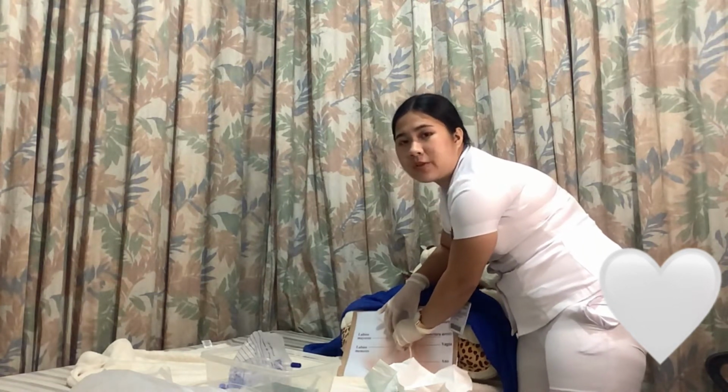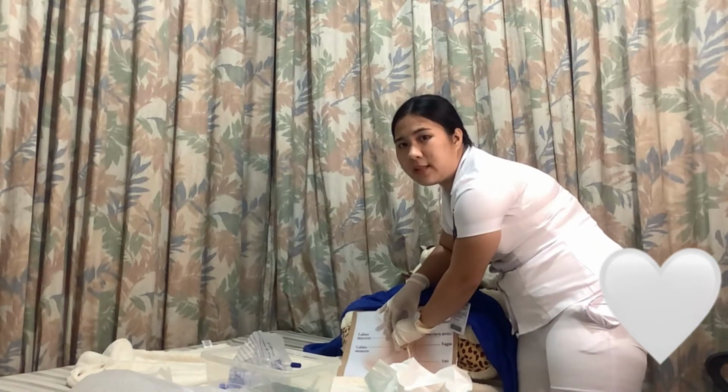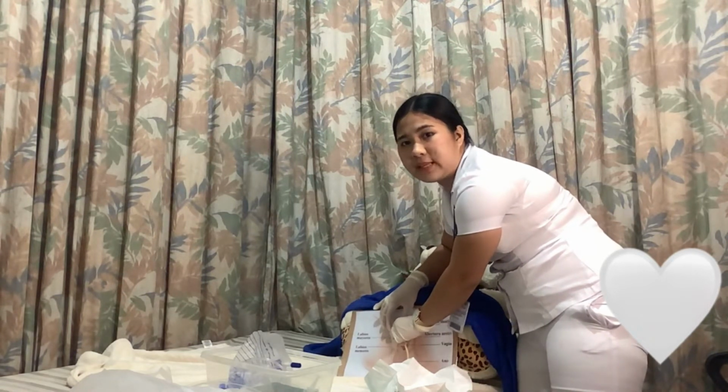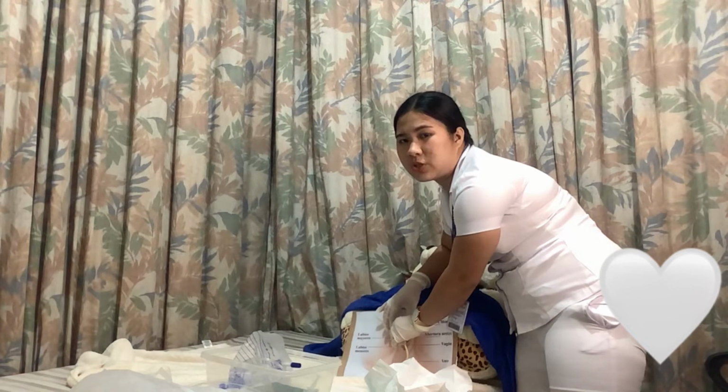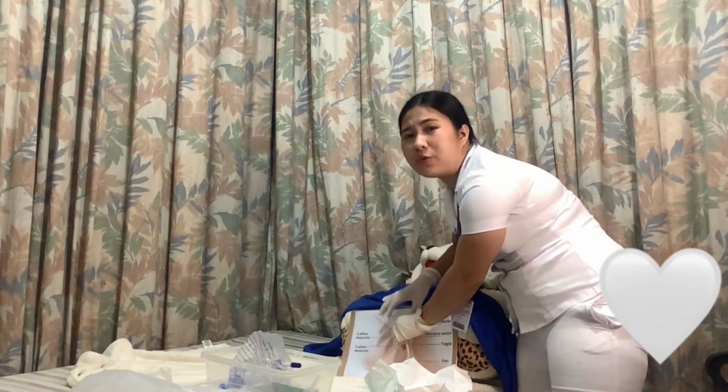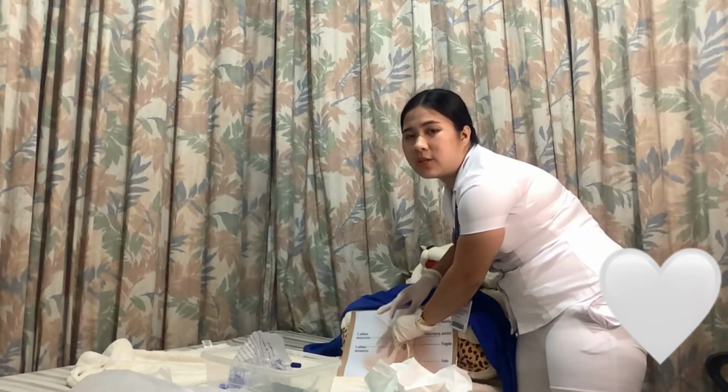Okay. So next, the first specimen is to be collected. Pinch the catheter with the thumb and the finger while placing the specimen container in position. So urine will flow out the catheter if the flow is not occluded.